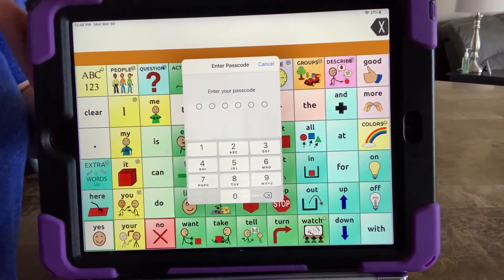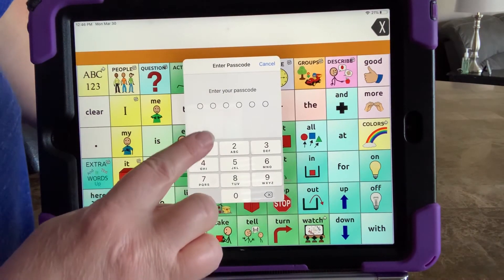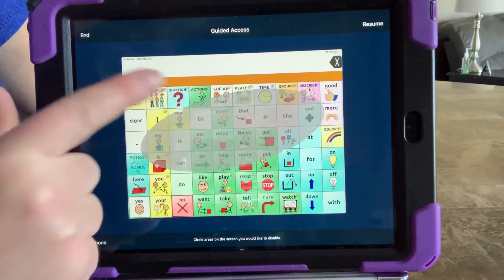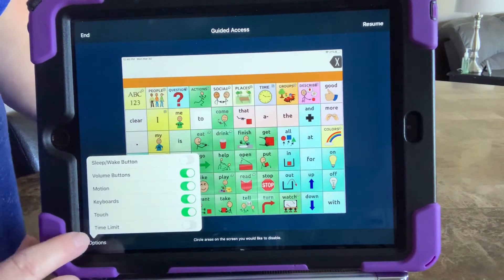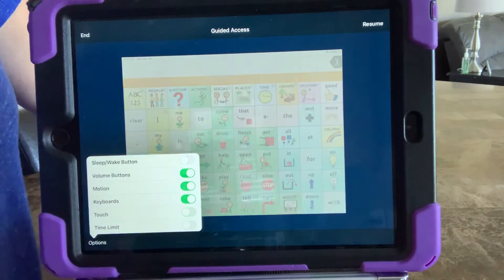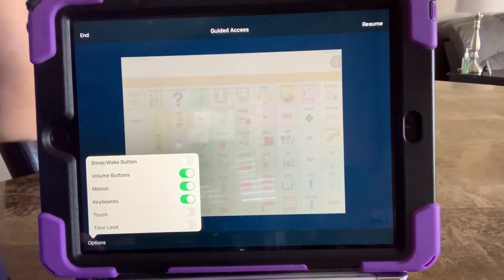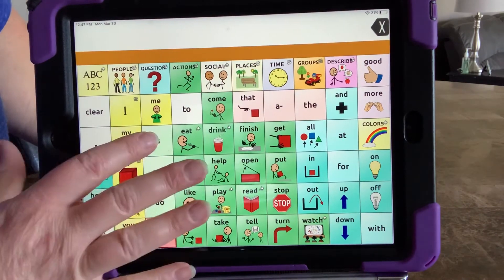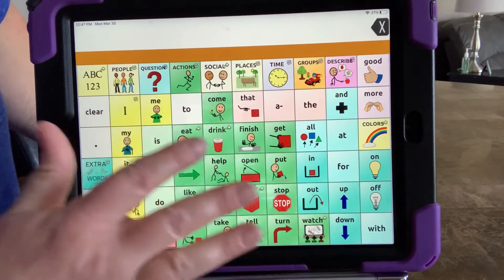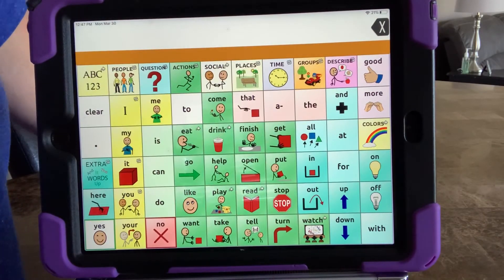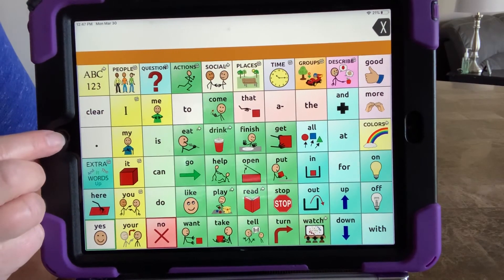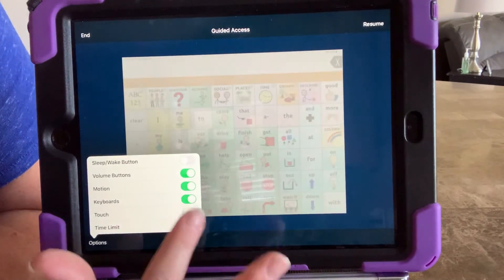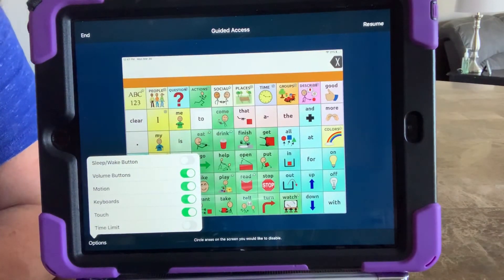If that does happen and you get a gray slice across your screen, you can go in and delete it — there's a little X to remove it. The other thing that sometimes happens is if the Touch toggle is turned off, the whole screen turns gray, and when you resume it looks like nothing is grayed out, but pages won't respond. If you're wondering why it isn't accessing pages or doing anything, it's because that touch limit has been toggled off. Make sure that stays on.